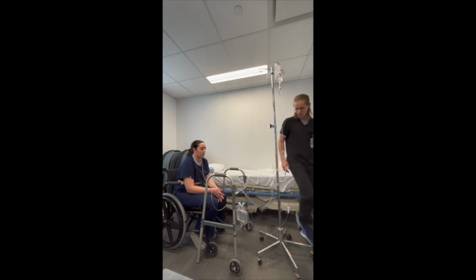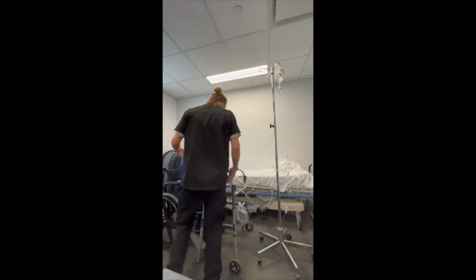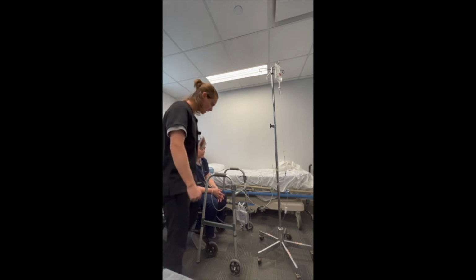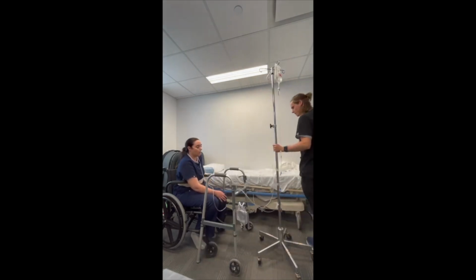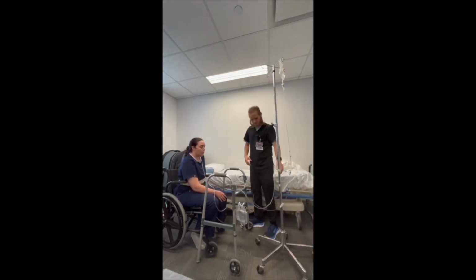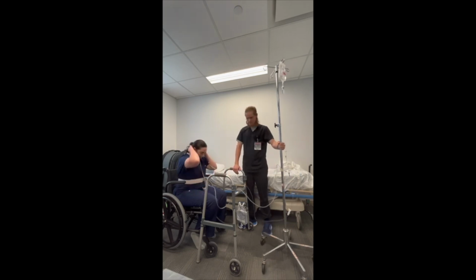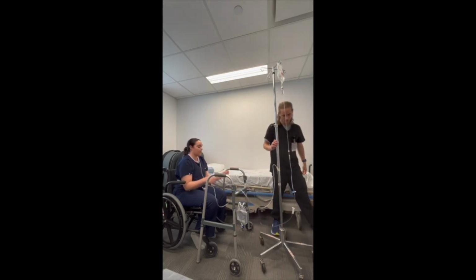Another thing you can do is, if I was walking with this patient and guarding on this side, keep the oxygen tank here, making sure it runs behind me so that I can still guard the patient safely and bring the oxygen along. But for this case, we're going to keep everything here running to the IV. We've got our catheter running here to the walker. That's all set.